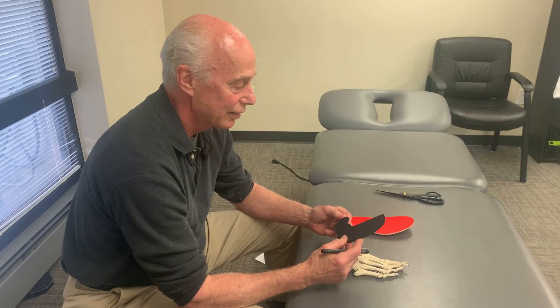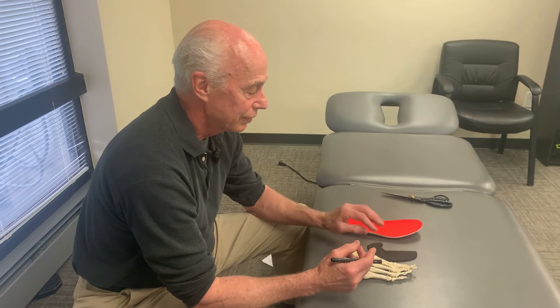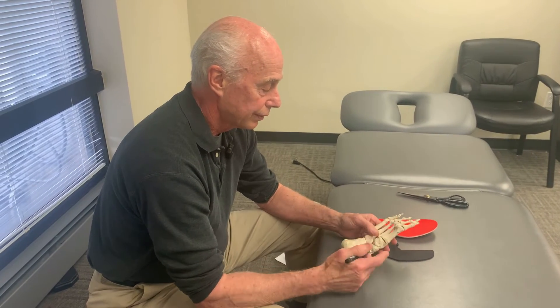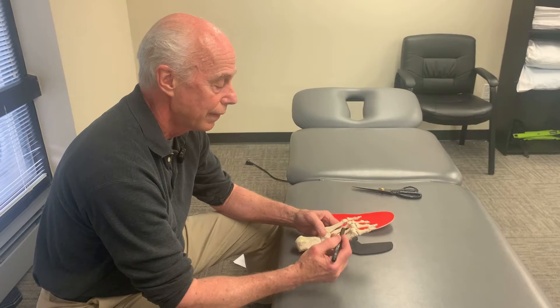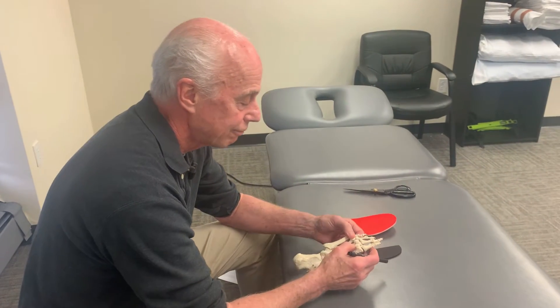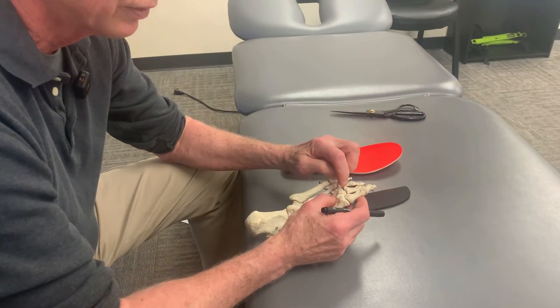This is a video on how to use the peel-and-stick interdigital pads. They were designed to treat interdigital neuromas. The medial and lateral plantar nerves split and form these little interdigital nerves — I'll put up a few pictures — that go between the metatarsal heads.